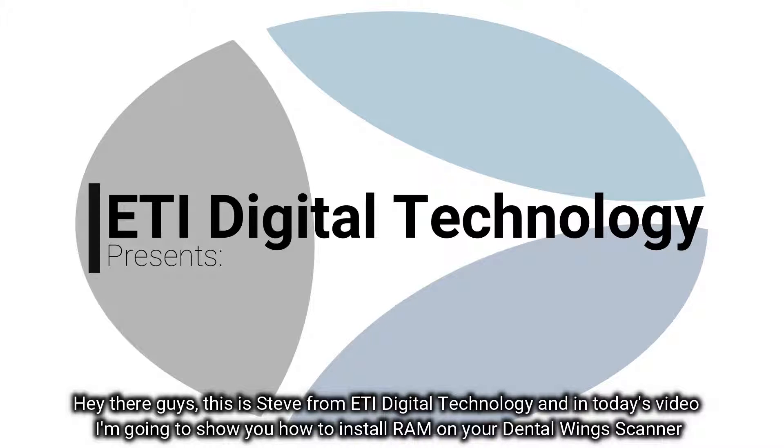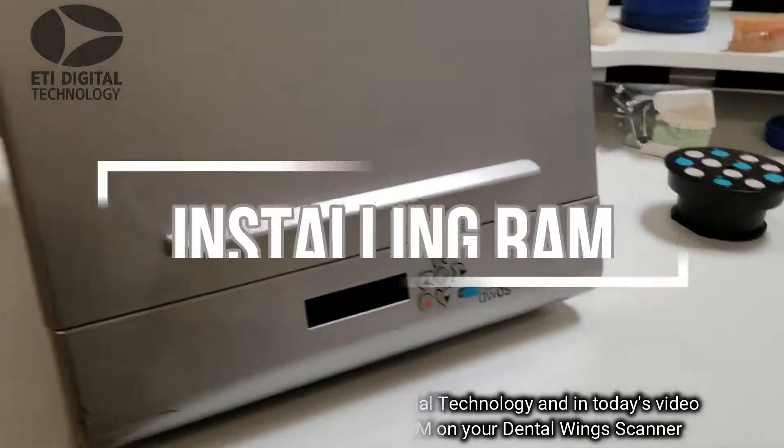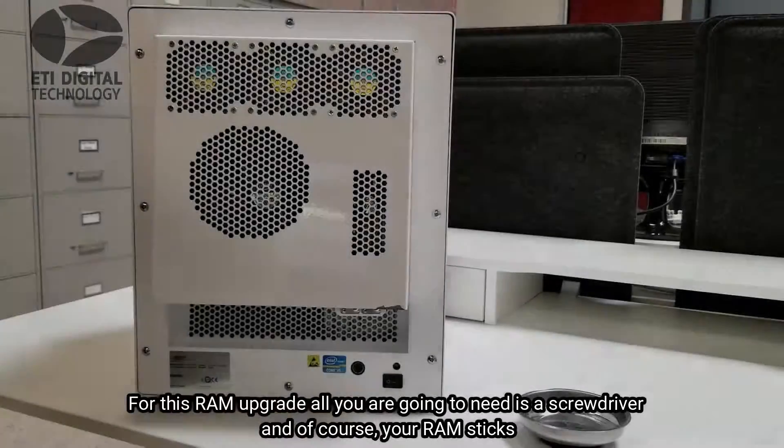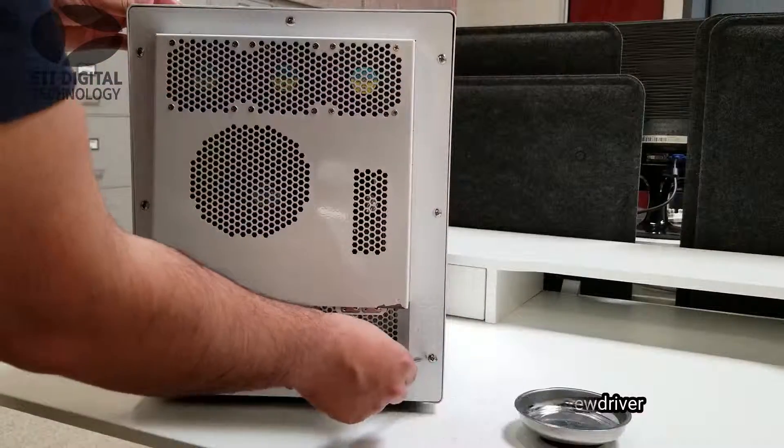Hey there guys, this is Steve from ETI Digital Technology. In today's video I'm going to show you how to install RAM on your Dental Wings scanner. For this RAM upgrade, all you're going to need is a screwdriver and of course your RAM sticks.